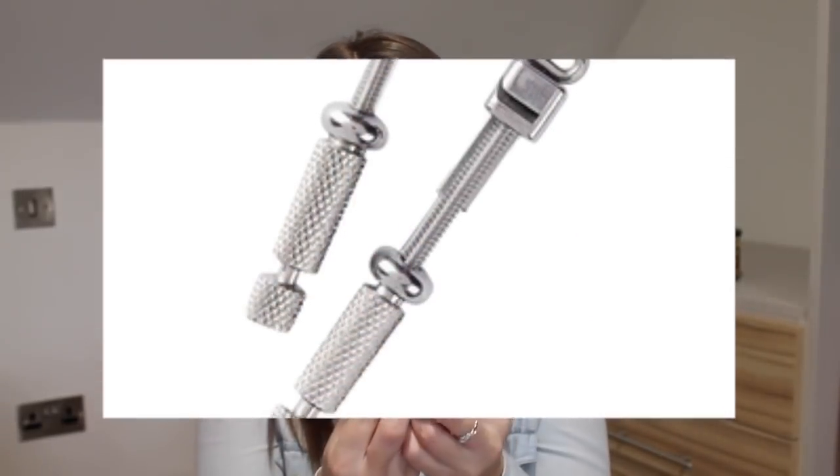Matrix bands are metal strips that go around the tooth. If you have decay between two teeth and you've drilled into that area, a matrix band stops filling material from spreading onto the adjacent tooth while still allowing the teeth to touch. Matrix strips are the see-through plastic versions used for front teeth like incisors and lateral incisors, while matrix bands go around the entire tooth and are used more for premolars and molars.